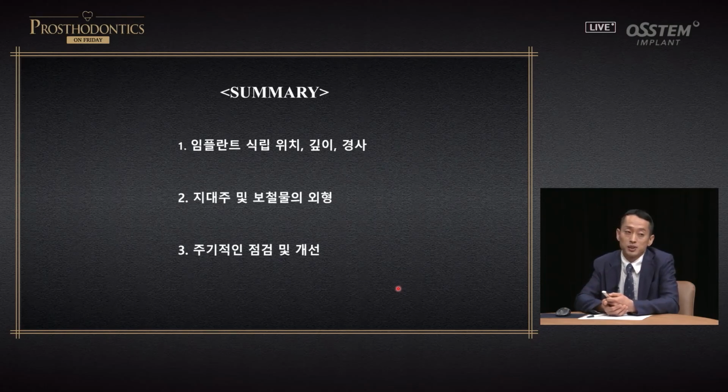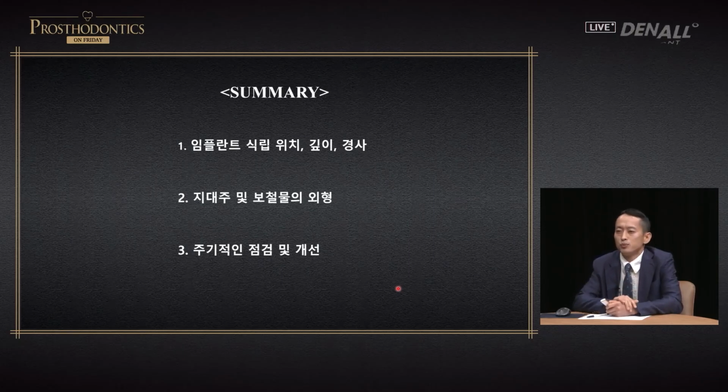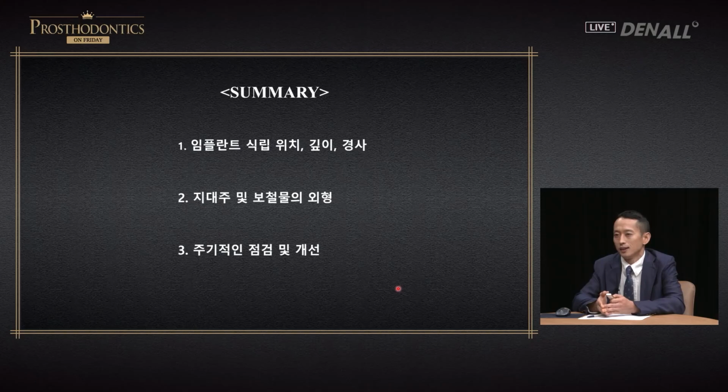In order to do so, I believe implant placement position, depth, and inclination are still very important. We need to think long and hard how to restore the masticatory function of the patient and prevent food impaction and to ensure good oral hygiene. This needs to be considered for every case. I believe with that, you'll be able to provide successful treatment.